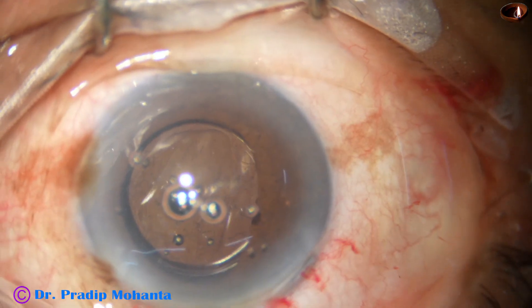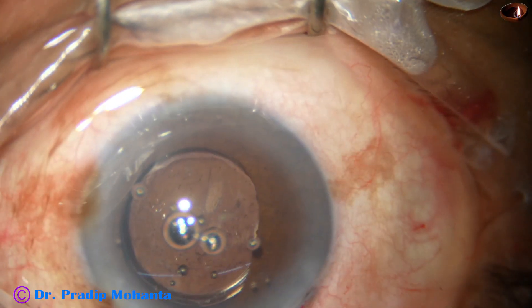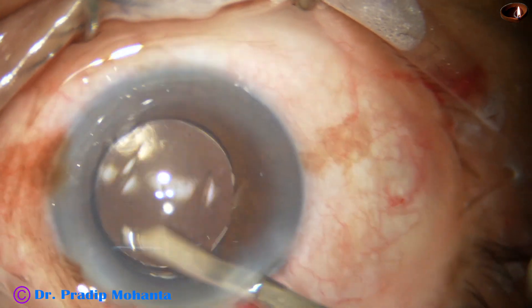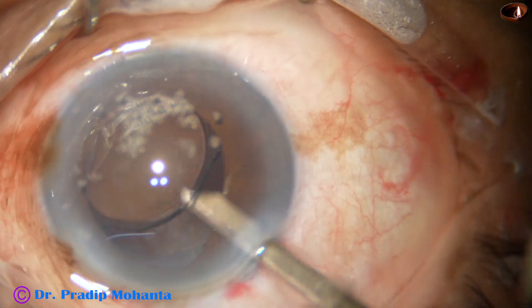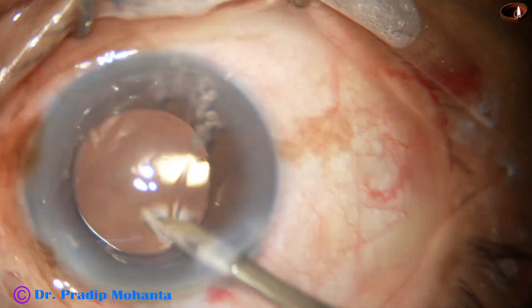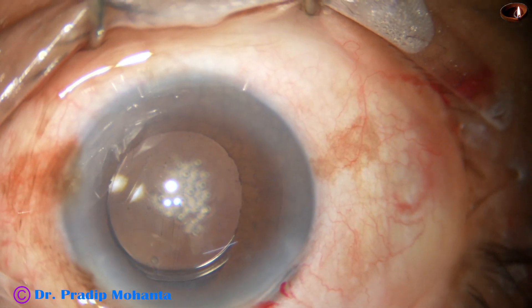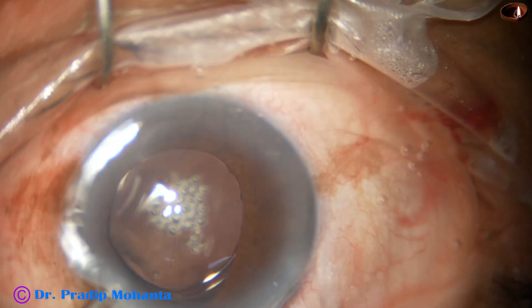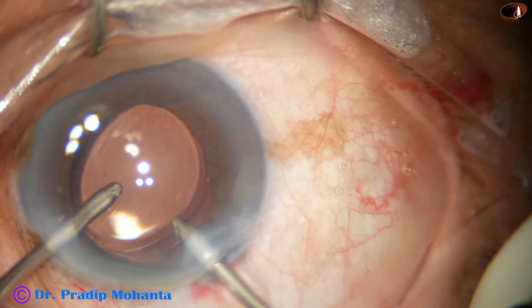Now we have to remove the visco used for implantation of the intraocular lens. First I use a 23G Simcoe cannula to irrigate the anterior chamber and the angle of the anterior chamber. Then I go behind the intraocular lens to irrigate the capsular bag, and then aspirate for some time. Now this is the irrigation and aspiration — irrigation in the right hand, aspiration in the left.